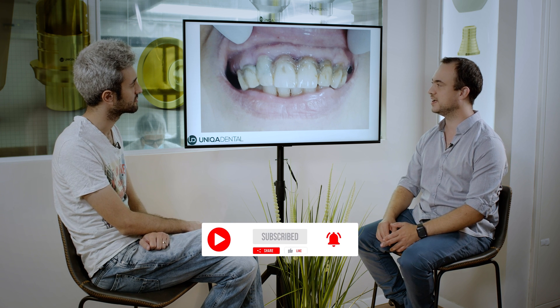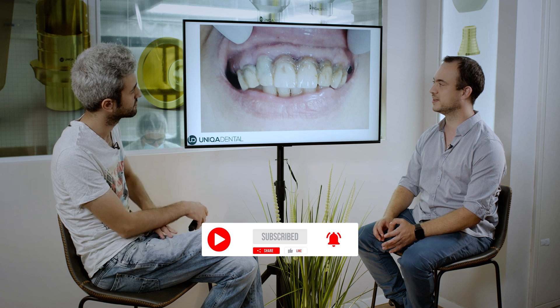So what do we have here? Here we see a very old bridge that was made probably from zirconia with gingiva from composite material. You can see all the pigmentation, all the colors it absorbed during those years, and when we removed the bridge we saw that from the teeth it was based on there is not much left.